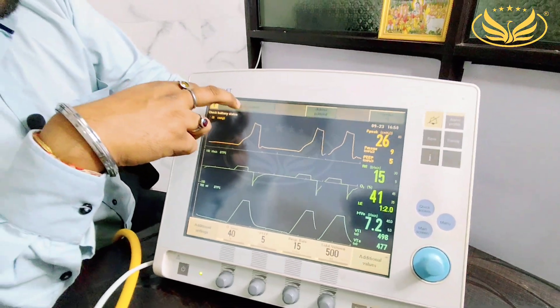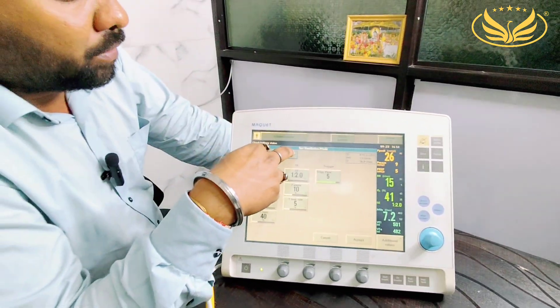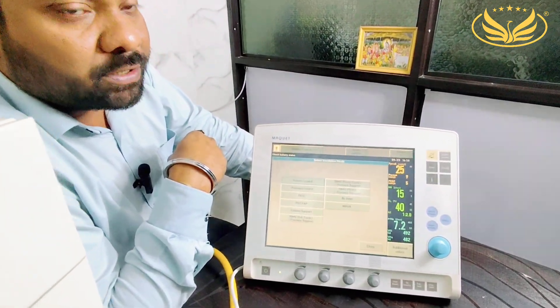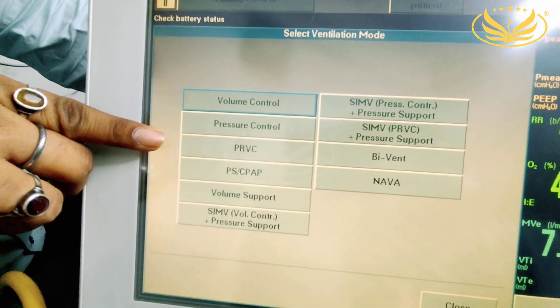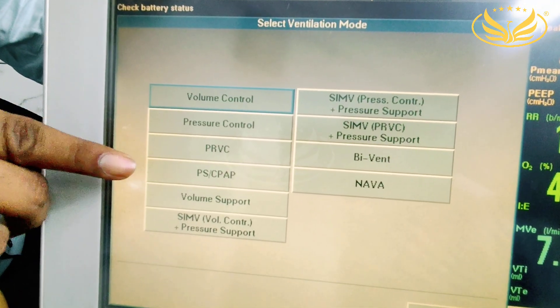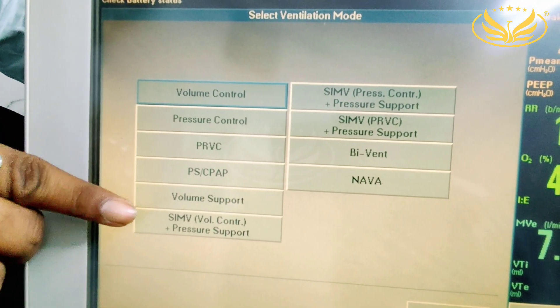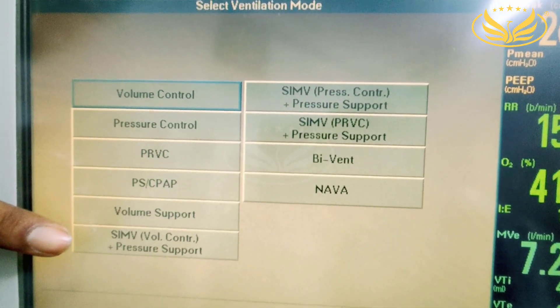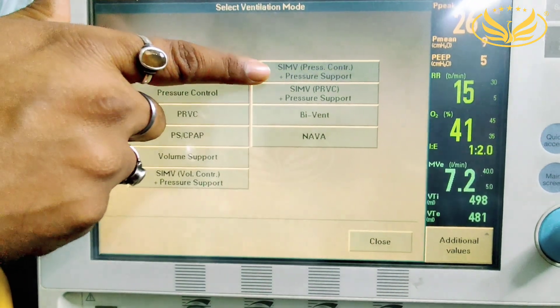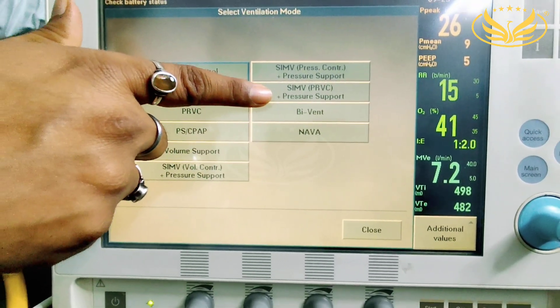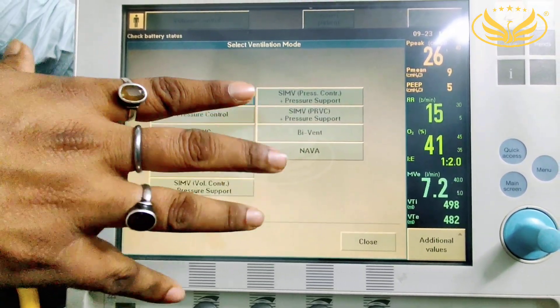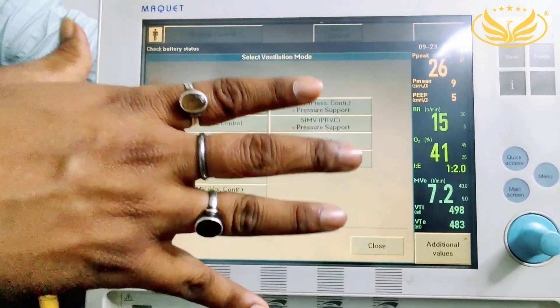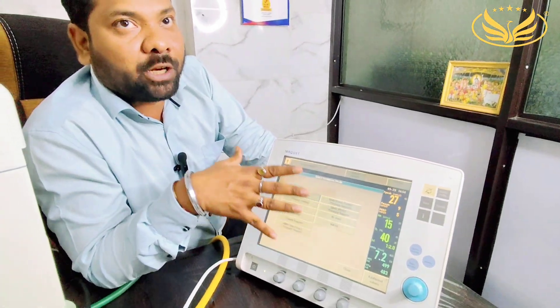From here you can select the ventilation modes. The modes available in this ventilator are: volume control, pressure control, PRVC (pressure regulated volume control), pressure support/CPAP, volume support, SIMV plus volume control plus pressure support, SIMV plus pressure control plus pressure support, SIMV PRVC plus pressure support, BiVent, and NAVA. This ventilator has all modes required for ventilation and treatment of patients.